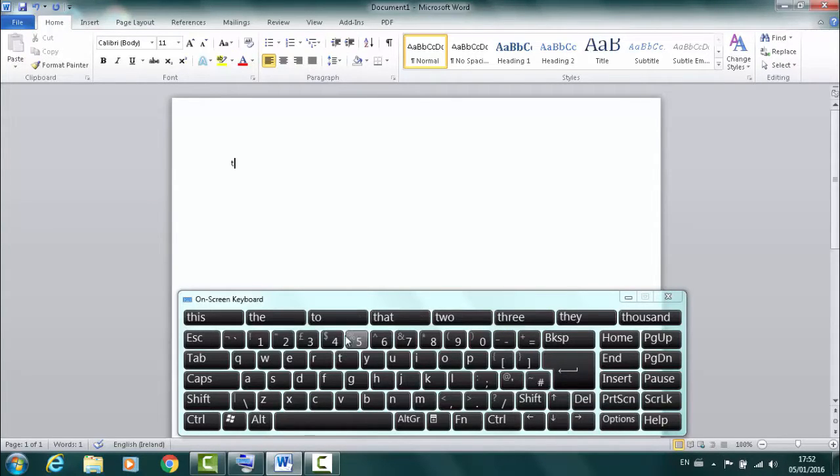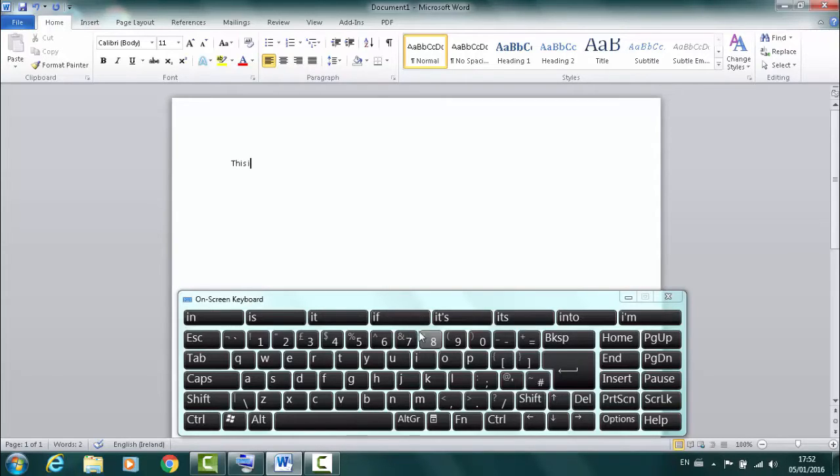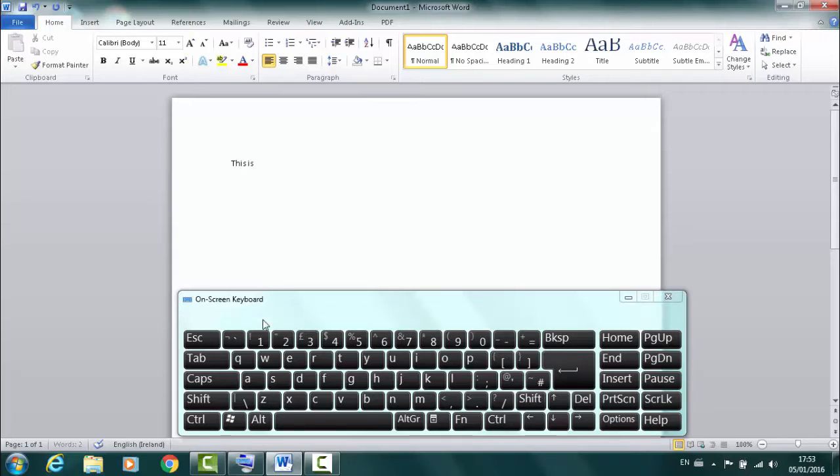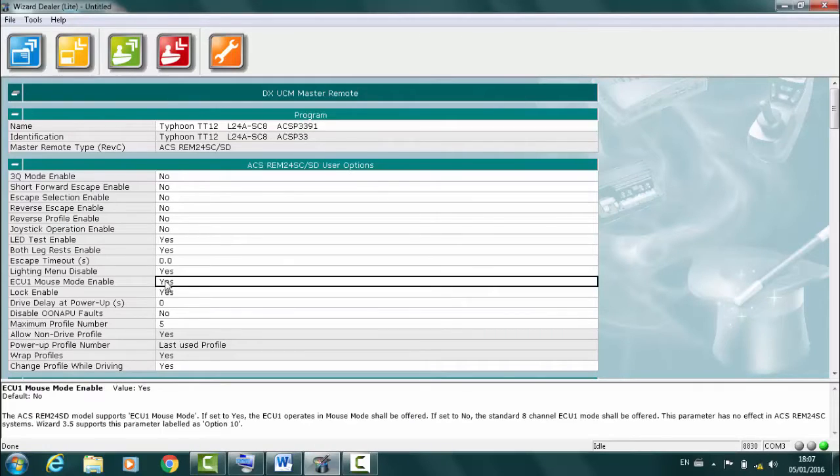A further switch can be added to provide the left click. Here's an example of using the on-screen keyboard with Microsoft Word, controlled using the wheelchair joystick.